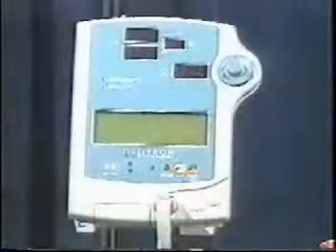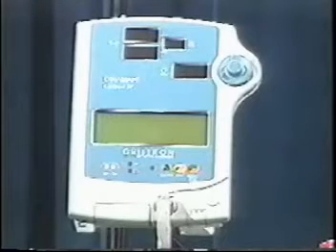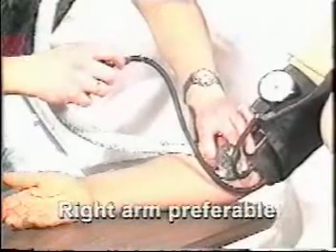And if you have that type of electronic blood pressure machine in your facility, check with the nurse who can rather simply explain to you how it works. Some points to remember when obtaining blood pressure measurement. Either arm can be used, according to the American Heart Association, for blood pressure determination. However, if both arms are perfectly capable of being used, they recommend that the right arm be used.